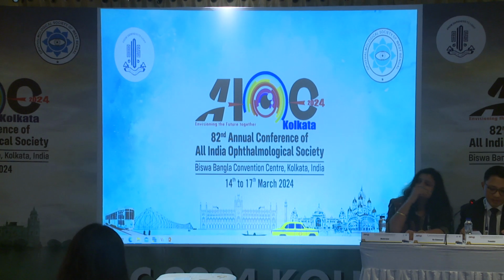Just one question. How accurate are you when you do the measurements with the ASOCT? Were they correlated intraoperatively? Did you do any surgery on them? Were any patients with esotropia or exotropia operated? Because ASOCT is a little variable when it gives your results. It's not that accurate. So they have to be correlated with your intraop findings before you actually have a study saying that this is the correlation with the axial length.